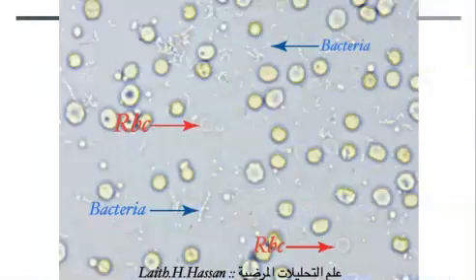Okay, this image is showing you what a red blood cell looks like. Think back to the white blood cell we saw on the previous slides and compare the difference between that white blood cell and this red blood cell. The red blood cell is smooth on the outside and doesn't have that graininess on the inside like the white blood cell.